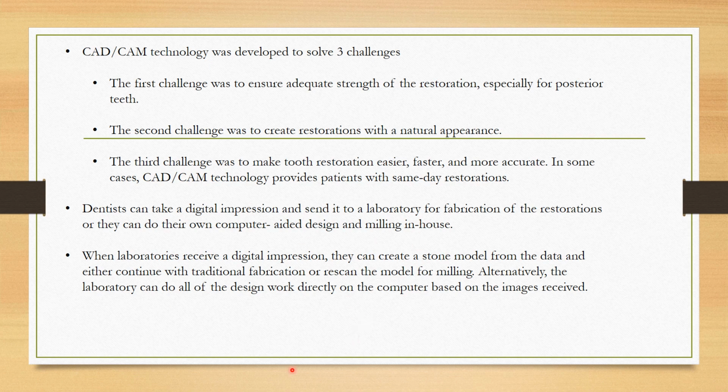When the labs receive the digital impression, they create a stone model from the data, and either continue to do the traditional fabrication or rescan the model for milling, and then they proceed further with the designing by the computer from what they have received.